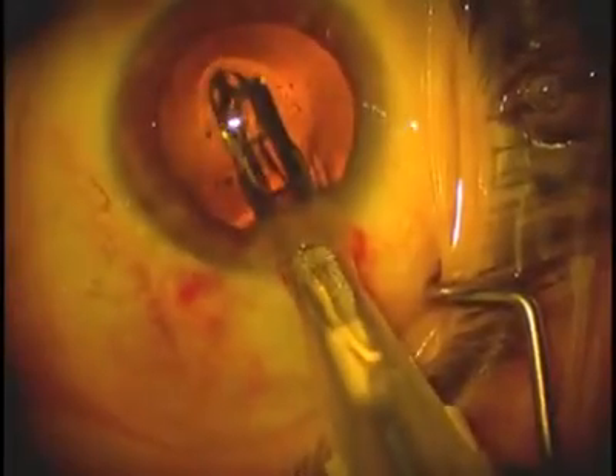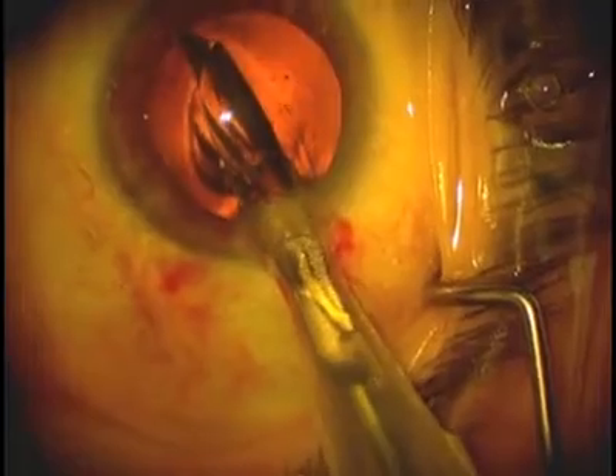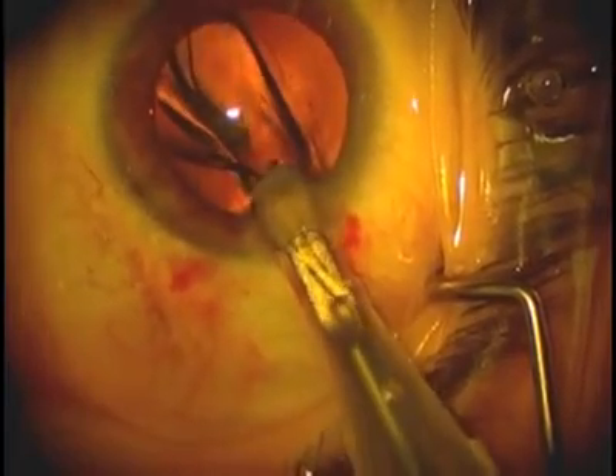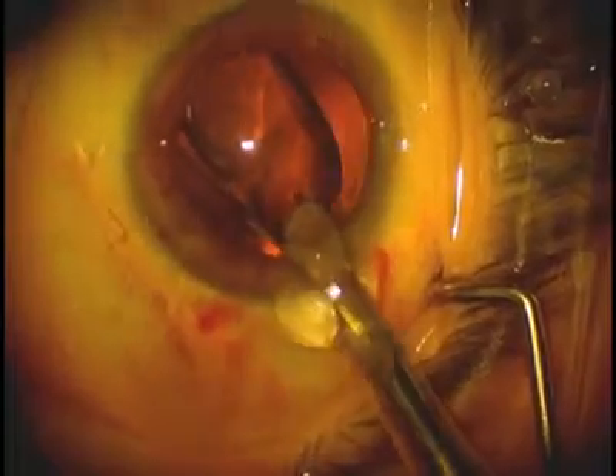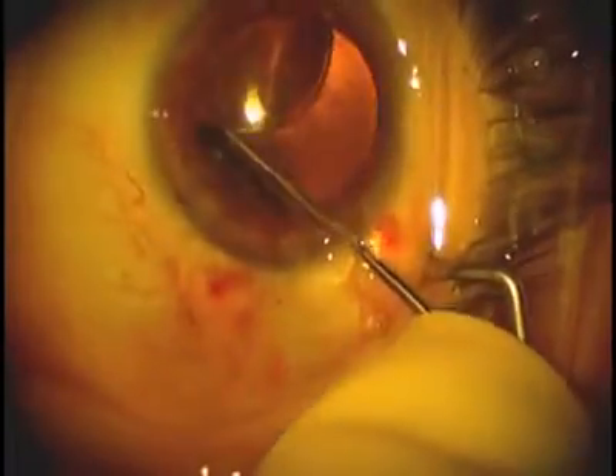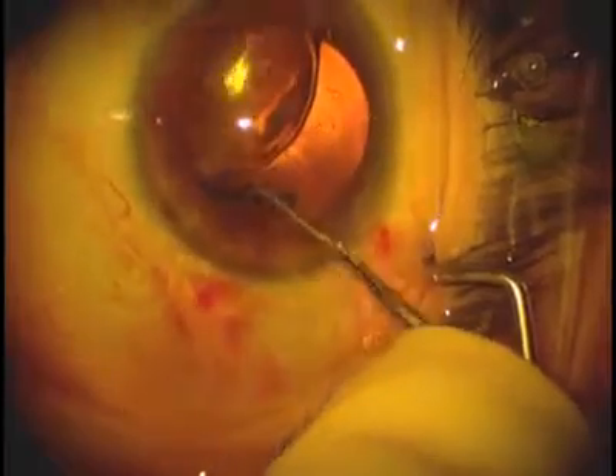Another IOL was placed. In this case there was no mar on the second try. You can see that the trailing haptic though is out a little bit, which made it a two-step process to place this lens into the eye.